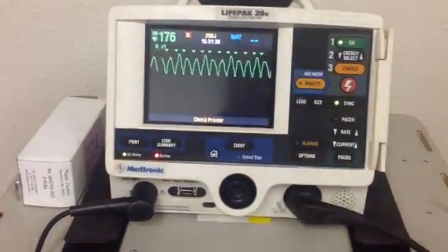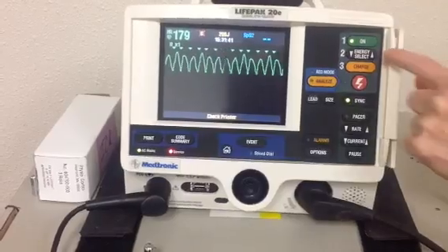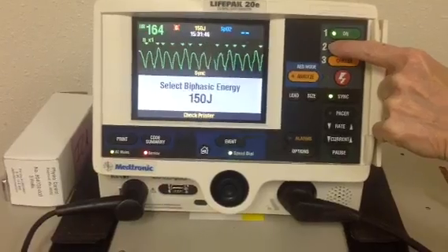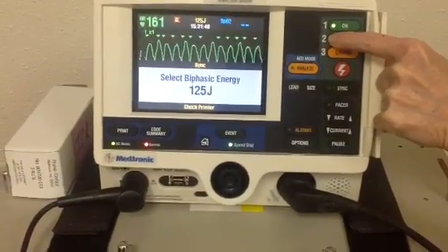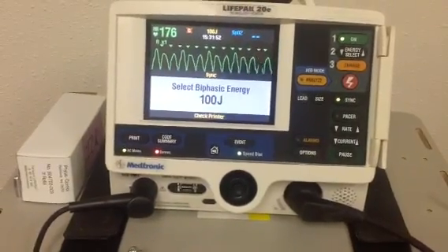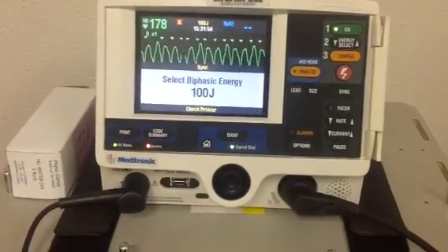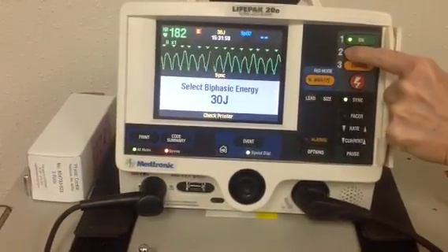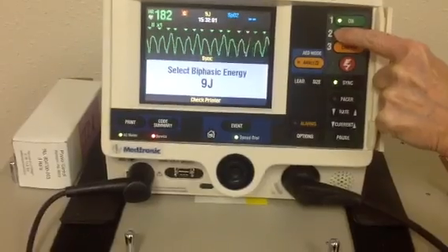Cardioversion is only done when you have a pulse. The energy you select for cardioversion is usually much lower than when you defibrillate. We have a wide rhythm and we're going to go to 100 joules in this instance. Because we don't want to accidentally shock anybody in the lab, for safety purposes we're going to go ahead and decrease the joules to 10 or below.